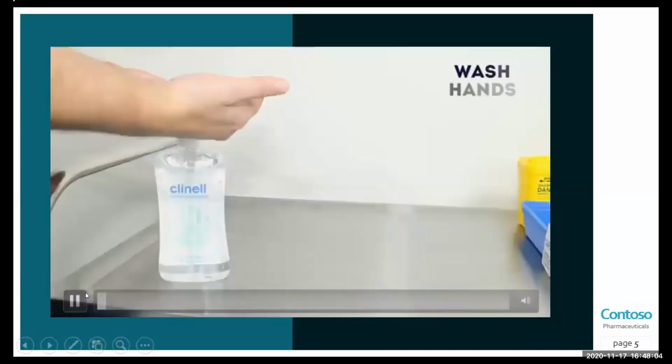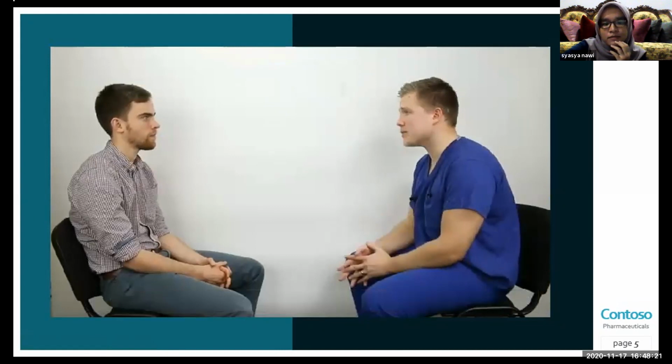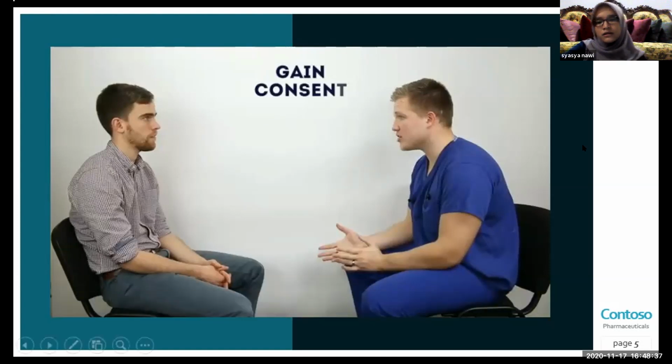Hi there, I'm a medical student. First of all, like always, you need to introduce yourself to the patient. Can I confirm your name and date of birth, please? Confirm the patient's details. Nice to meet you, James. Today I've been asked to insert the cannula into your arm. Explain to the patient about the procedure and also gain the consent. It might be a bit uncomfortable, but it won't be painful. Is that okay? I'll just gather my equipment and then we'll begin.